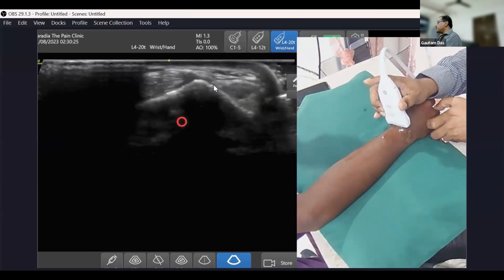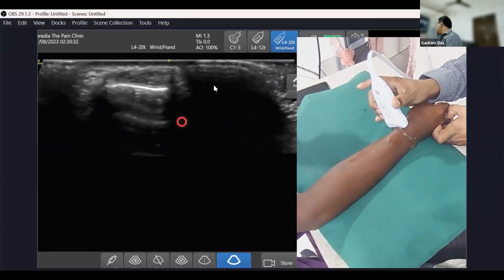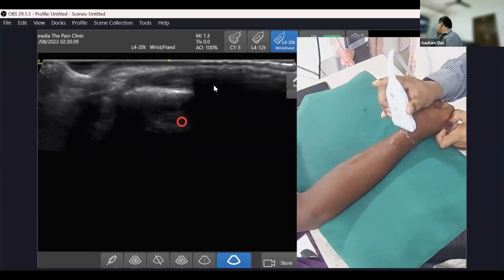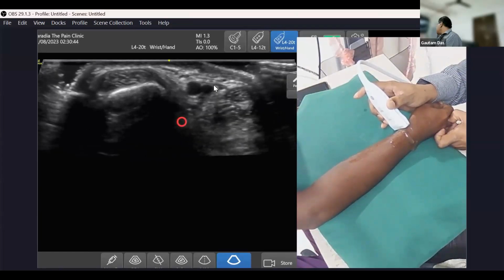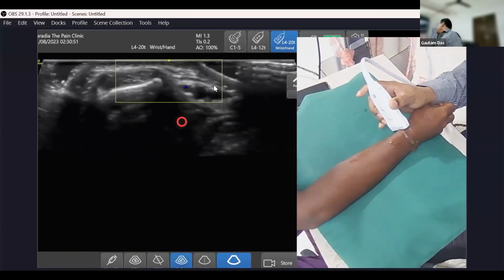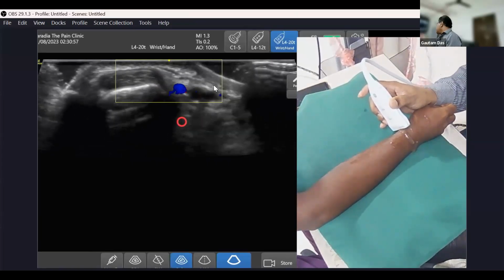And then I am turning the hand, and here you can see the two tendons nicely. Now see here, you can see the pulsations of the radial artery. If I am coming here, pulsation of the radial artery. Can I appreciate it? I can give color also. So this was the radial artery. And now look at the first compartment tendons.